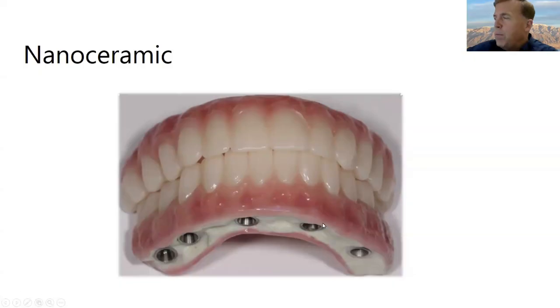The other thing is that we have to bond the tie bases in place, so we need to do a hybrid digital analog workflow, whereas the other two can do pure digital.